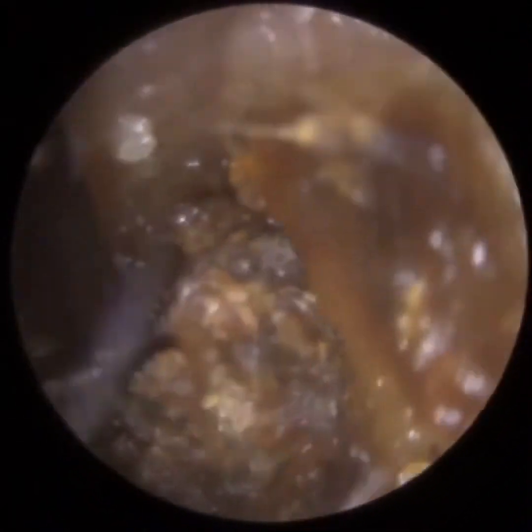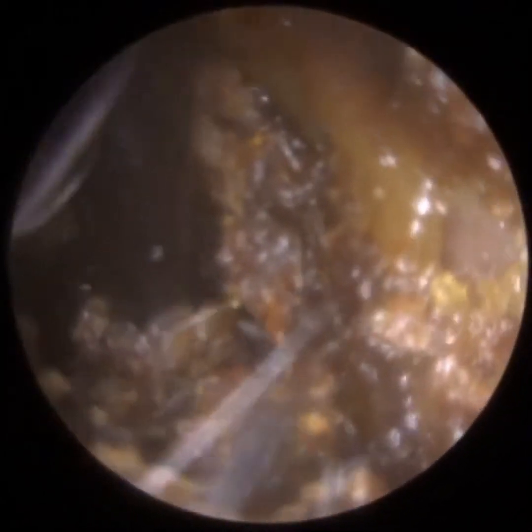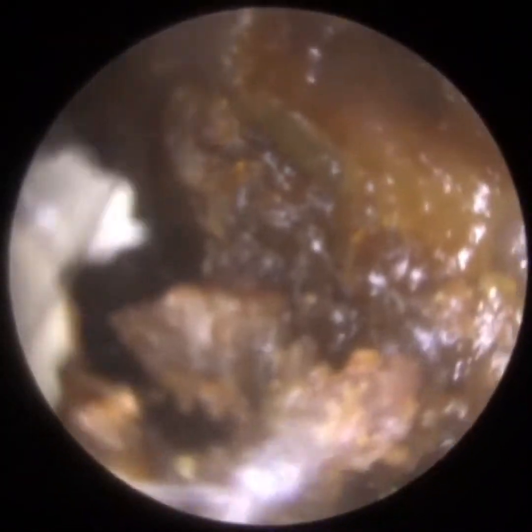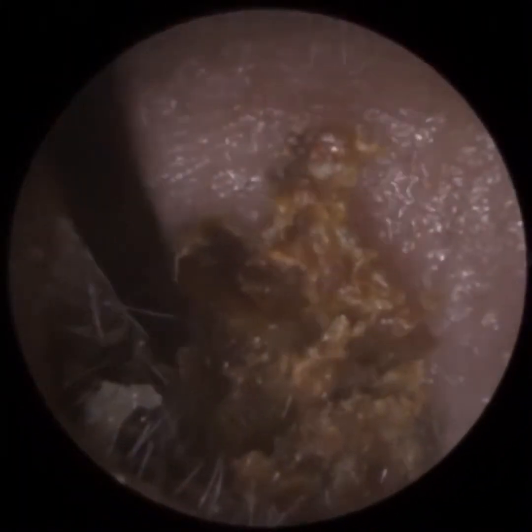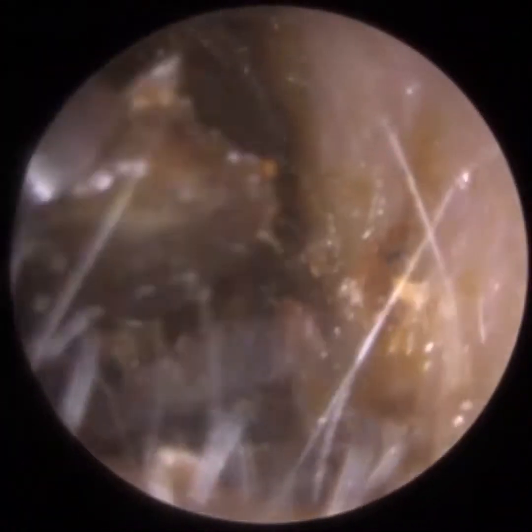So I had to really calm the patient down, I had to reassure them. On my ENT couch, I've got a headrest, so I asked the patient to sit back and relax. And I was just constantly talking to the patient throughout the procedure just to put them at ease, telling them what I was doing. Quite often, as you can see in the procedure, we weren't really entering the ear, and all the instrumentation was on the outer third, so there's no need for the patient to be worried at all.